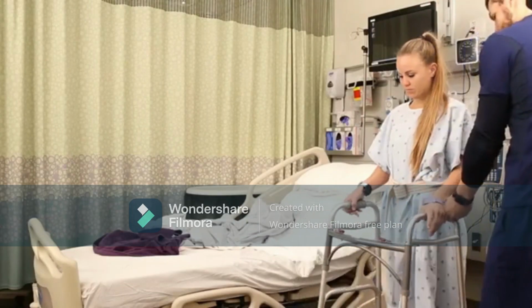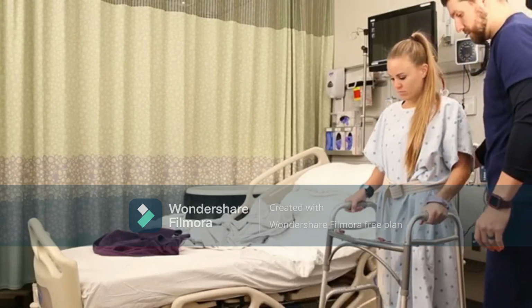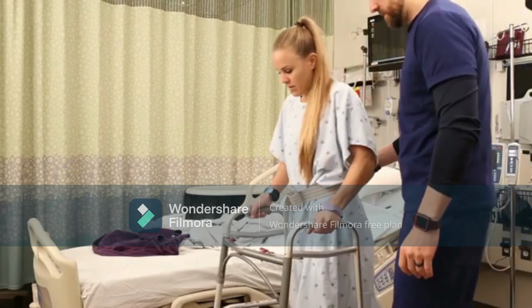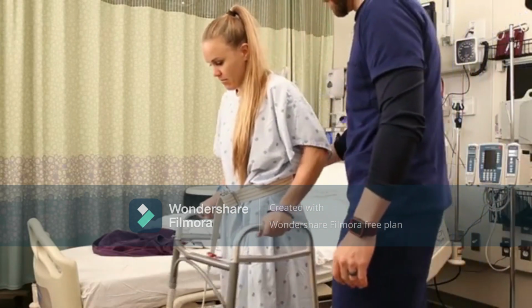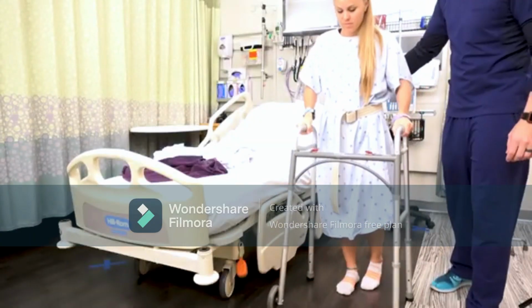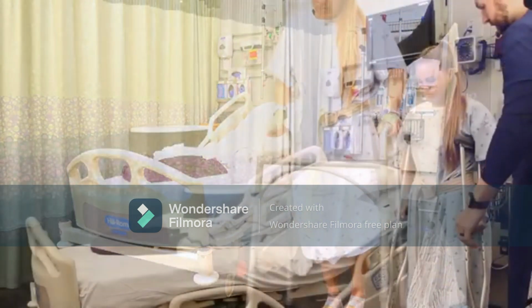Now let's say we want to use a walker. In this case, the same principle applies. Walker, bad leg, good leg. Now it's really important that they understand that they should be advancing their bad leg with the walker. Walker, bad leg, good leg.